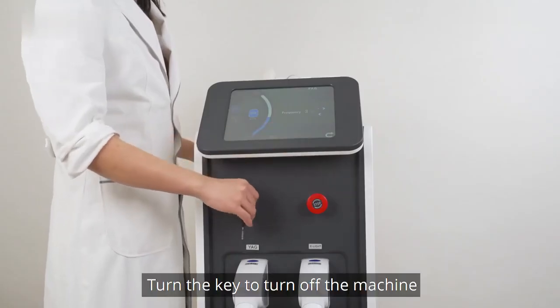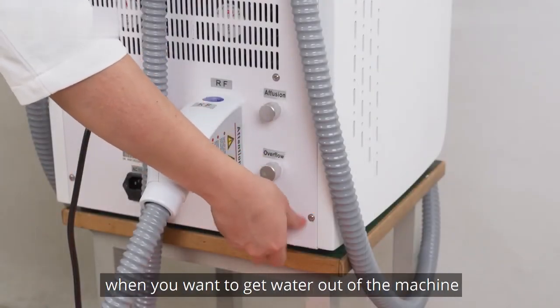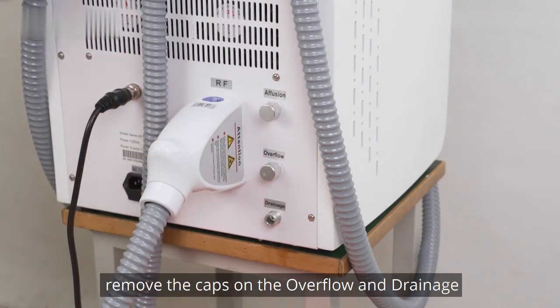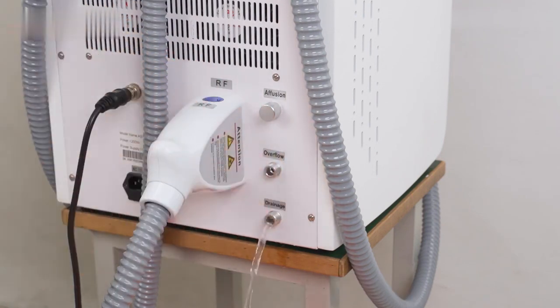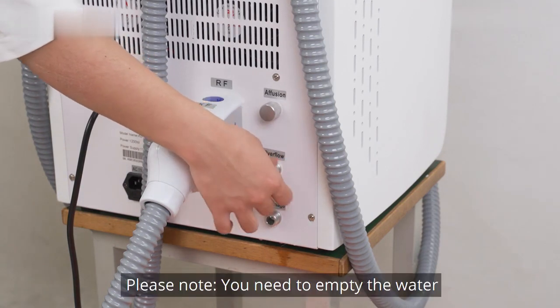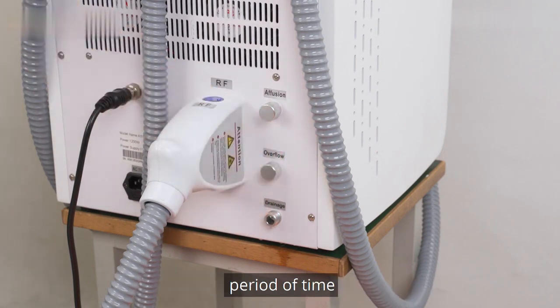Turn the key to turn off the machine. To empty water out of the machine, remove the caps on the overflow and drainage holes and the water will automatically flow out. When water is emptied, put the caps back and screw them tight. Please note: you need to empty the water out of the machine if you keep it idle for a long period of time.